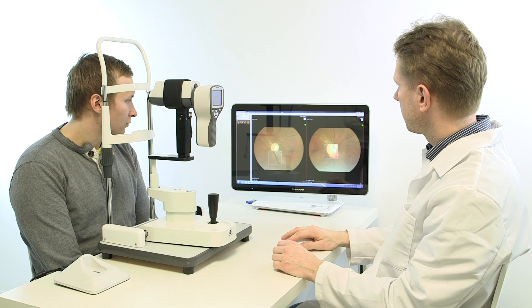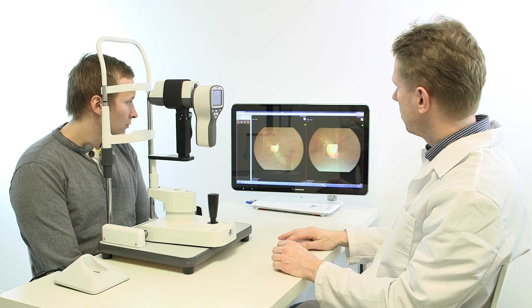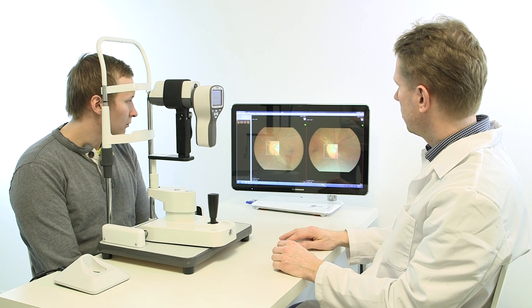the doctor may recommend a fluorescein angiography to assess if the blood vessels in the back of the eye are receiving adequate blood flow, if there are any leakages or any abnormalities.